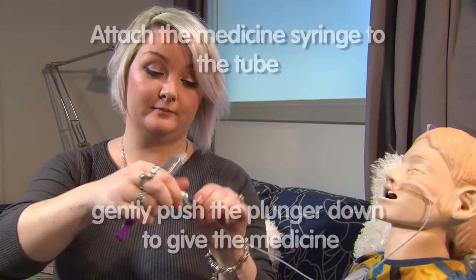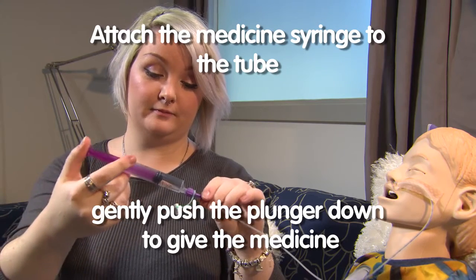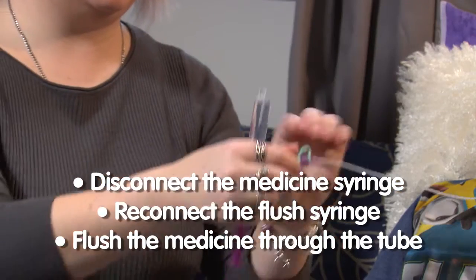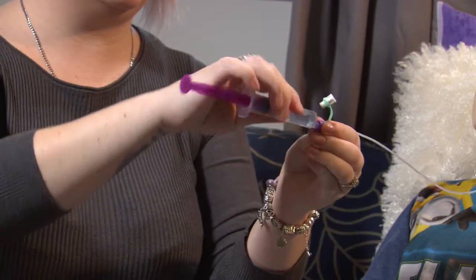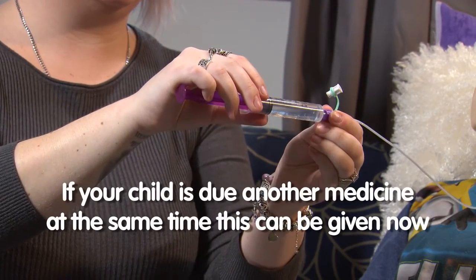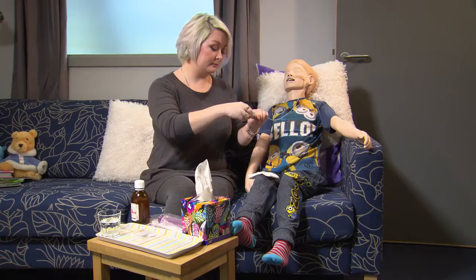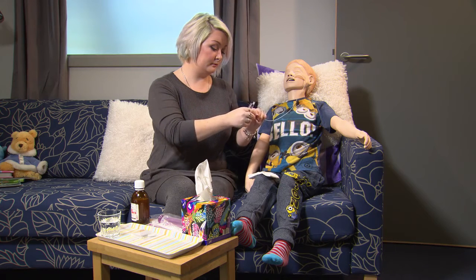After flushing, attach the syringe containing the medicine to the tube and gently push the liquid into the tube. Now disconnect the syringe containing the medicine and reconnect to flush the medicine through the tube. If your child is due another medicine at the same time, this can be given now. You should flush the tube between each medicine with water, although this could be dependent on your child's needs. Speak to your doctor and specialist nurses to clarify this.